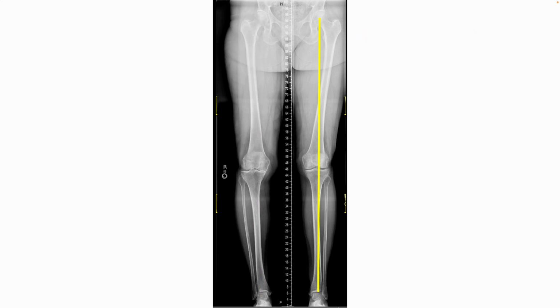The mechanical axis of the lower extremity can sometimes give us an idea of the varus or valgus deformity of the knee. In this case, this knee on the left is ever so slightly valgus. On the other hand, this knee on the right side is in varus.